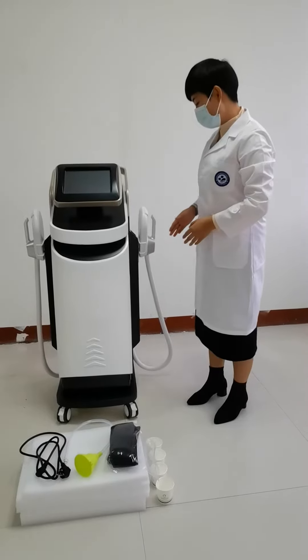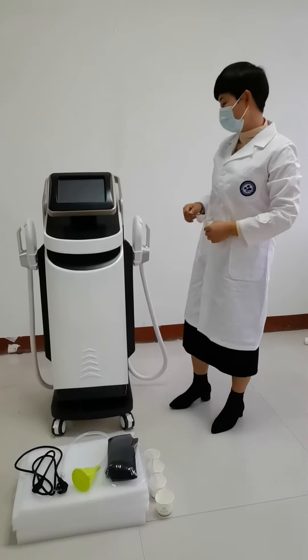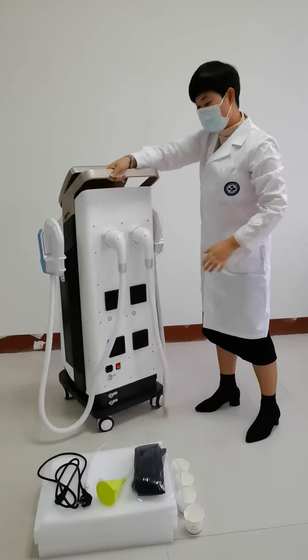Firstly, install the handle brackets on both sides of the machine. It's very easy. Then, secondly, connect the handle with the machine.